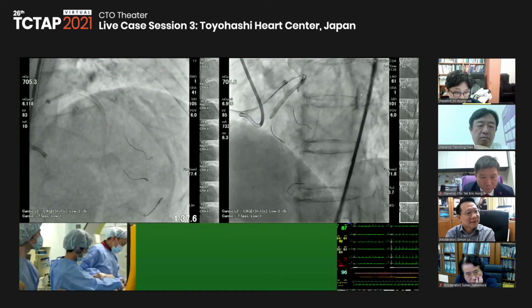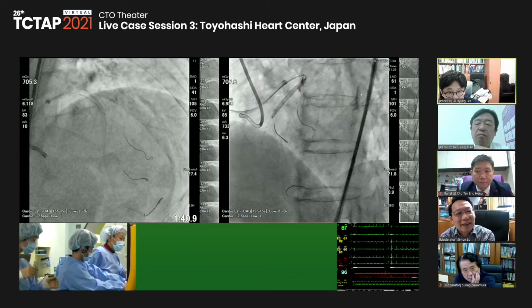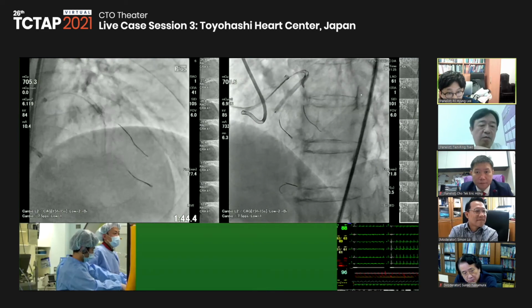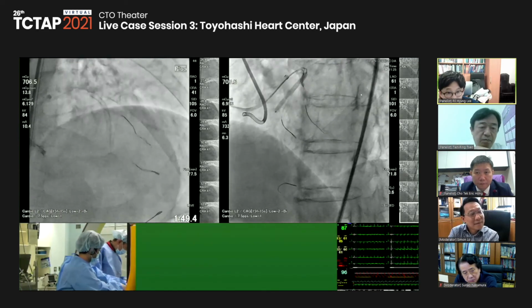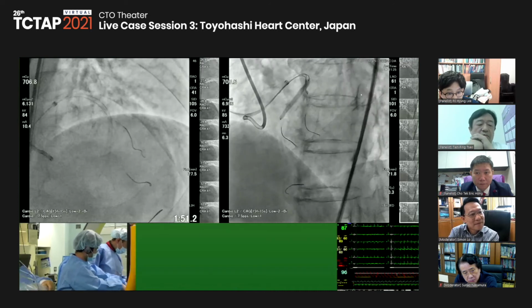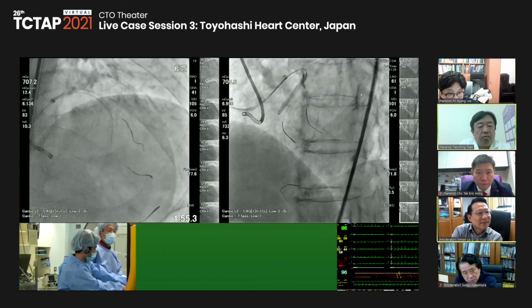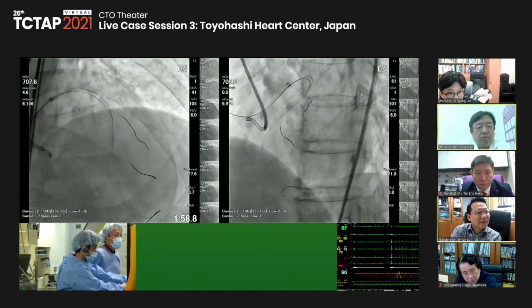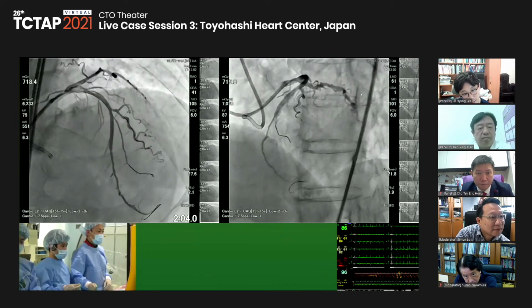You mean the angiogram now, right? Yeah, maybe if the diagonal is compromised, then it's better to wire it first before post dilating. Yeah, of course. Now I want to select the diagonal before post dilatation. It's okay. Nice. Fortunately, the second diagonal is also okay.